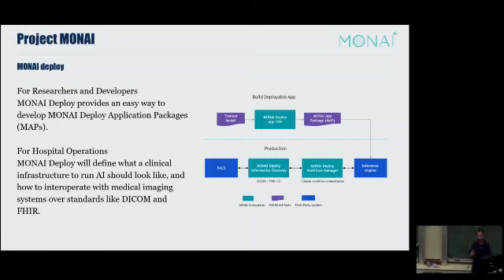And then there are as well all of the parts that will integrate with your clinical system, so that you've got orchestration of your apps on top of that. And by orchestration, I mean we detect that a T1 weighted MR is acquired for suspicion of dementia, then we start the container that should run the tool that is related to diagnostic of dementia, for example.